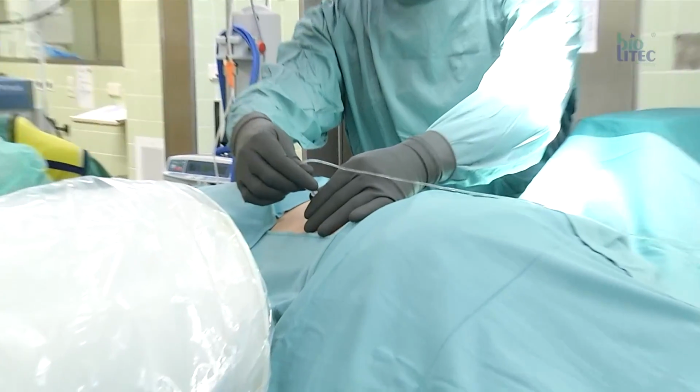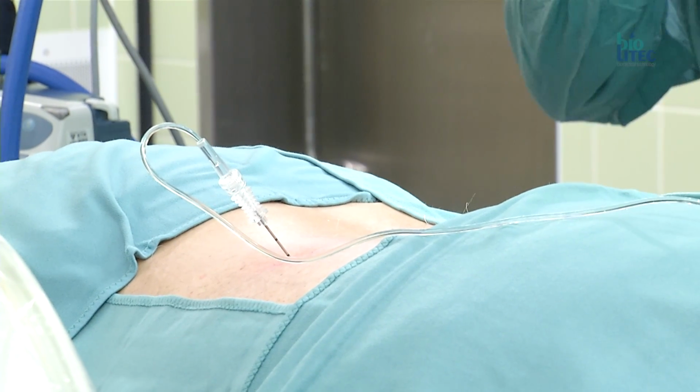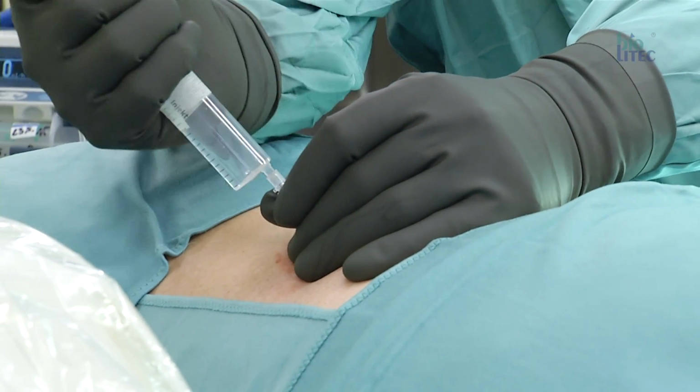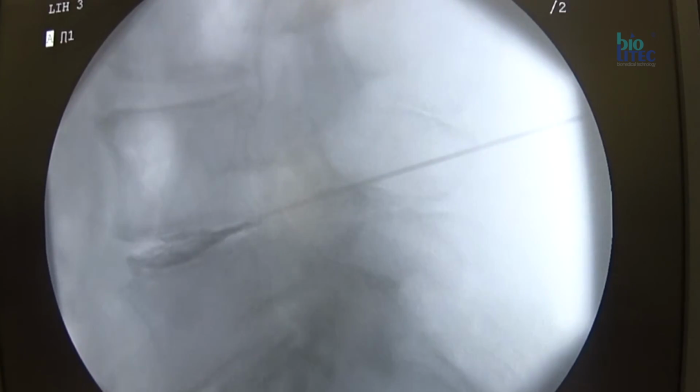A discography with contrast medium leads to further information about the condition of the disc. A memory pain test, which is a provocative test because of an intradiscal pressure increase, is also a good diagnostic tool and is routinely performed before treatment.